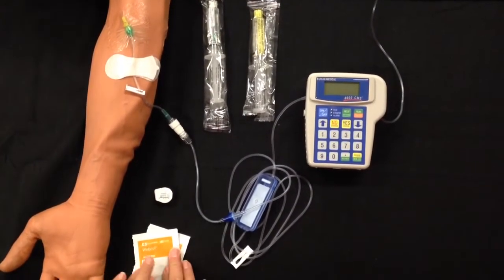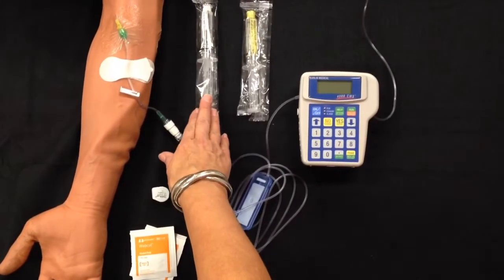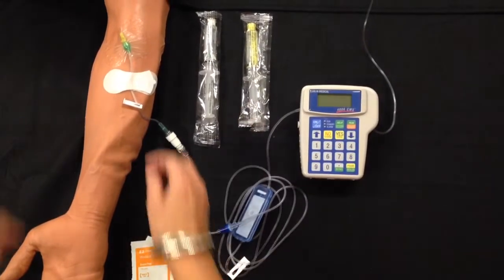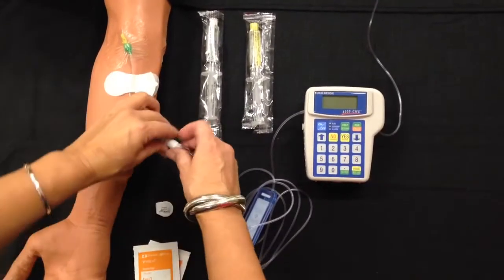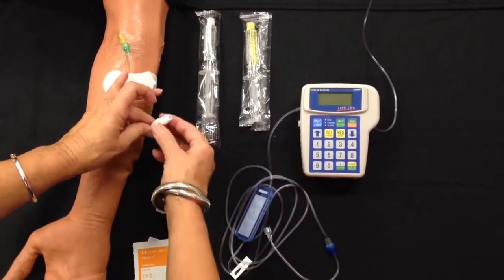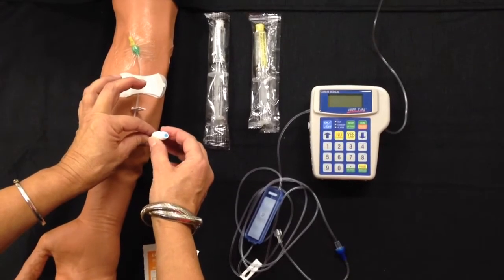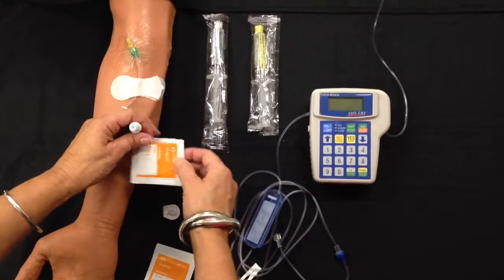You'll need to gather up a few more supplies, some alcohol wipes, a swab cap, another saline syringe, and a Heplock syringe if you've been instructed to finish with Heplock. First, clamp your line. Remove the tubing from the injection cap. Make sure that you leave the injection cap on the IV line. It protects the line from air and from bacteria. Do not remove that. Open an alcohol wipe.